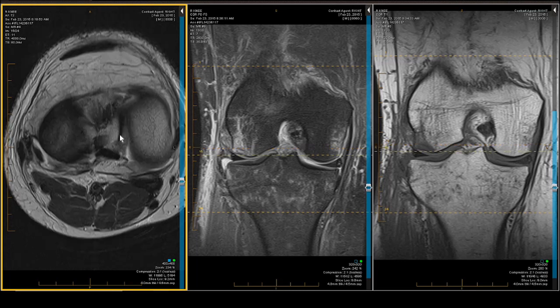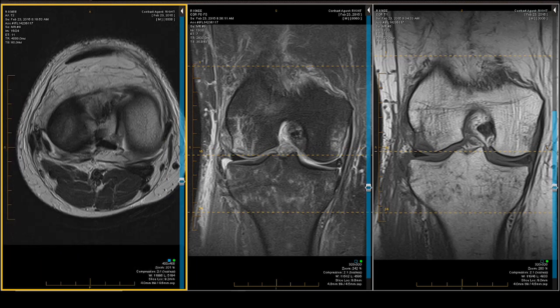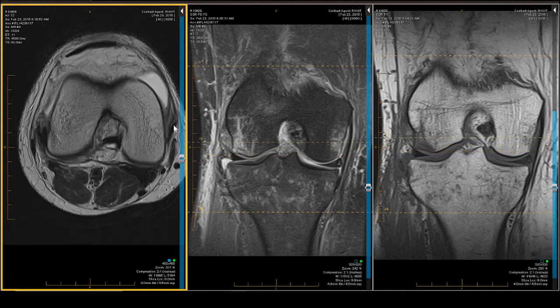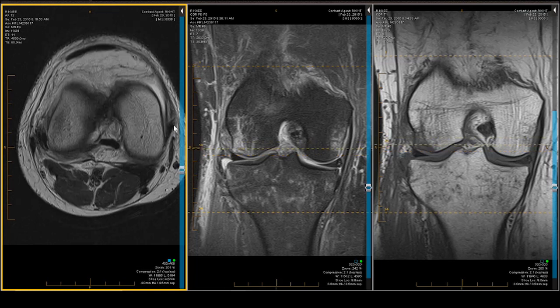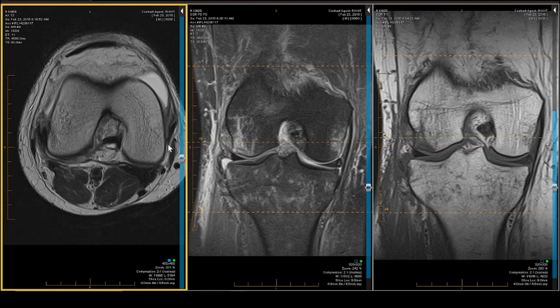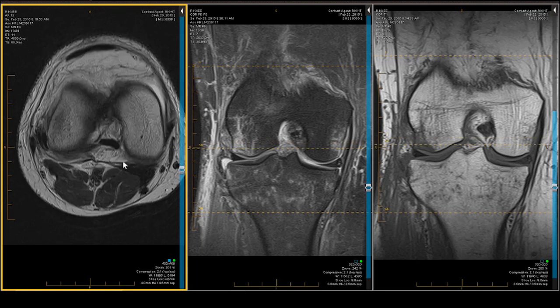This is the axial projection, which many of you might ignore with regard to posteromedial or posterolateral corner pathology. Let's get you oriented — this would be the medial side. You can see the middle layer of the MCL standing out quite nicely. Behind it is the POL, the posterior oblique ligament of the knee, and that transitions into the OPL, which goes across the knee.